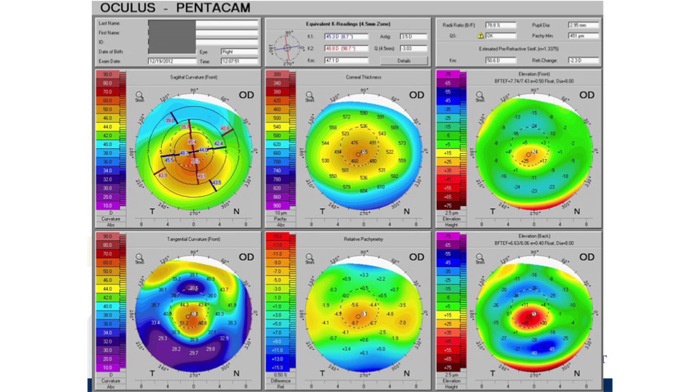We have all types of fancy equipment that we use for keratoconus. Topography is one, but I think more powerful than the topography is something called tomography, which looks at not only the front part of the cornea, but the back side of the cornea. These are all different maps of the same cornea, and this shows the front part of the cornea, and you can see this asymmetry that Matt was talking about, asymmetric astigmatism. You can see this hourglass here, it's just bigger on the bottom, smaller on the top, and this is asymmetric astigmatism. But if you take this on itself, that's very indicative of keratoconus.